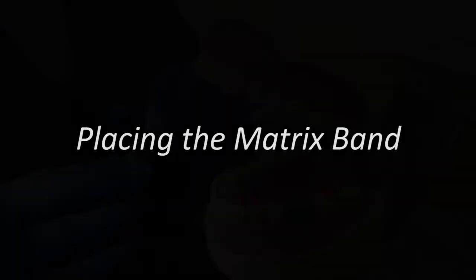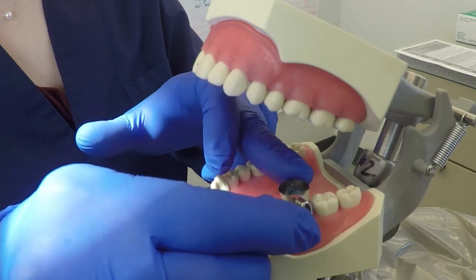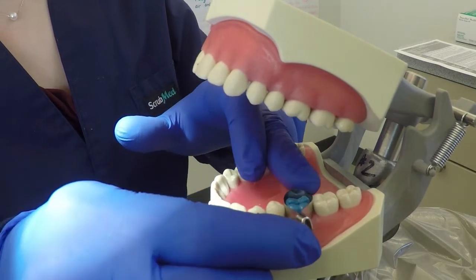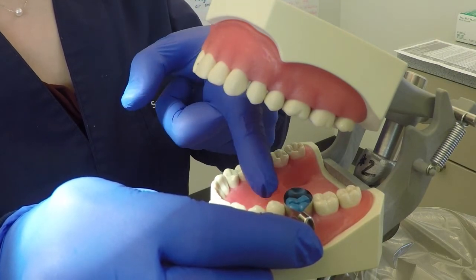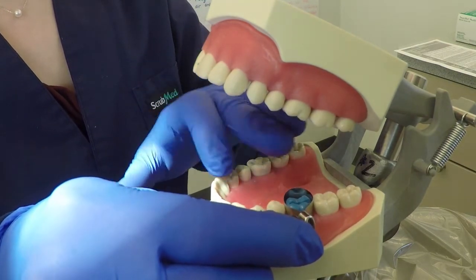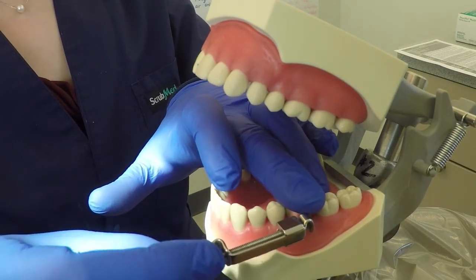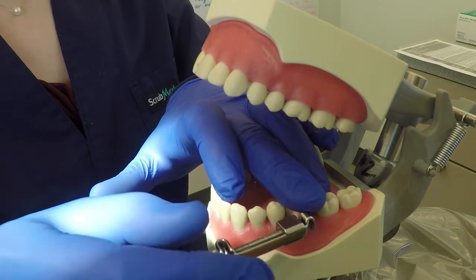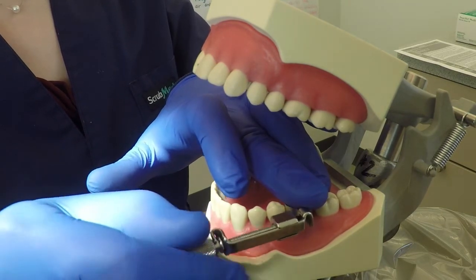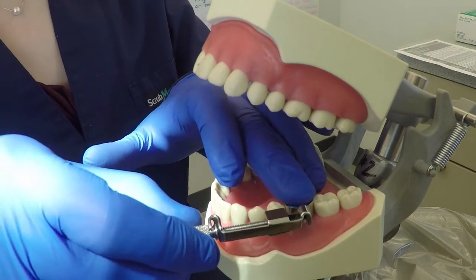Slide the matrix band around the tooth so that the retainer is positioned on the buccal aspect. If you have difficulty sliding one of the proximal areas between the teeth, try placing a wedge first to slightly separate the two teeth. Tighten the band around the tooth by holding the band securely and turning the inner knob clockwise. Ensure that a fully seated band completely seals the gingival area of the preparation to prevent amalgam from escaping during condensation.